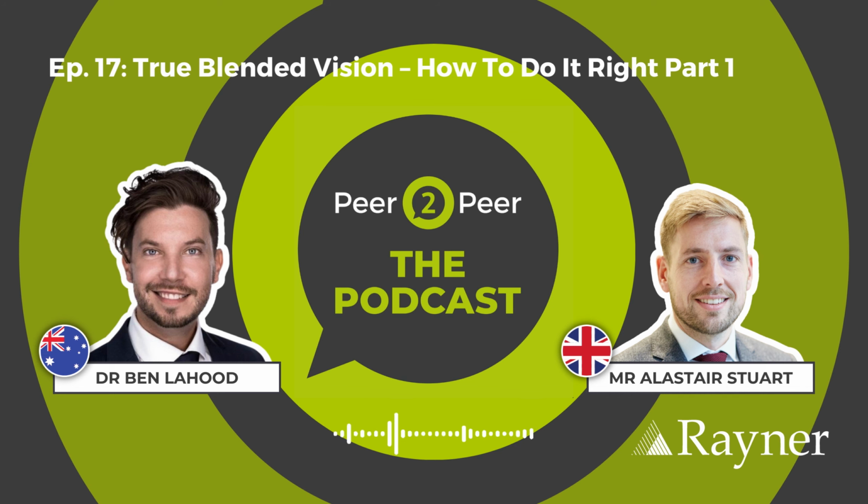Now, we all know about monovision, where we make one eye for distance, one eye better for near vision. And I think we've all heard Graham Barrett especially talk about aiming one eye for emmetropia, the other eye for minus 1.25, hitting the sweet spot of gaining some near vision without compromising distance. But I hear that you're aiming for what we call true blended vision or enhanced monovision. So can you tell us how that works?